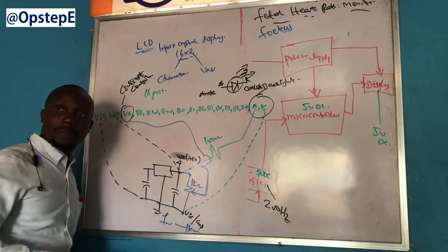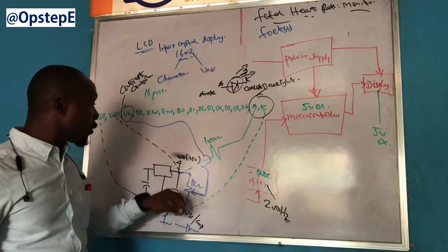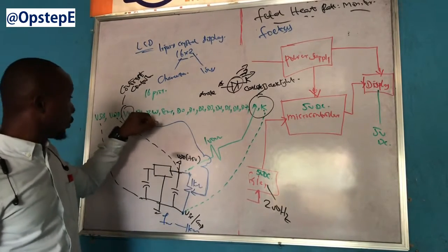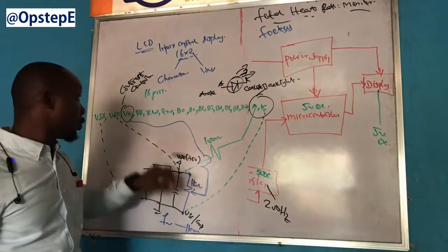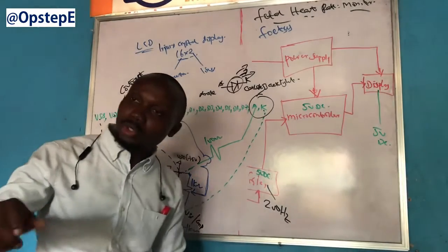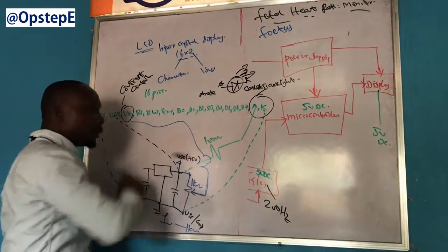So instead of having a permanent resistor here, say across either your VDD to your VE or your VSS to your VE, what we do have is a variable resistor whose control we can turn to vary the voltage supply to the VE.